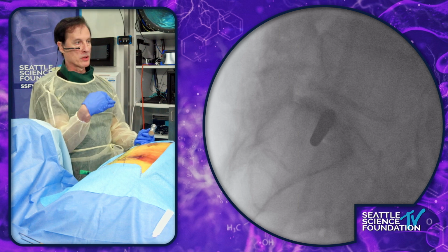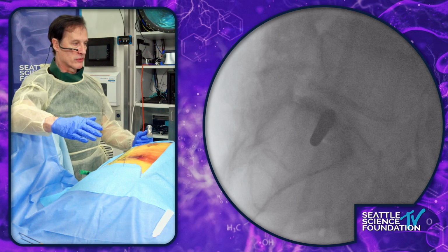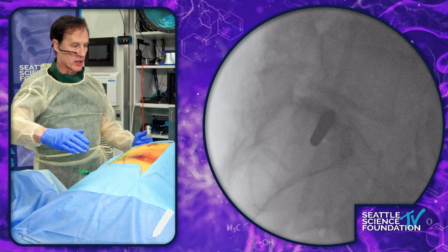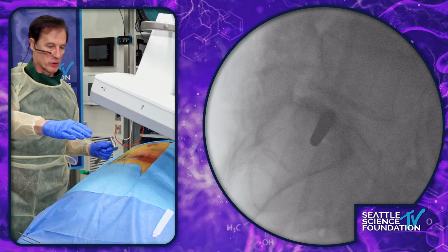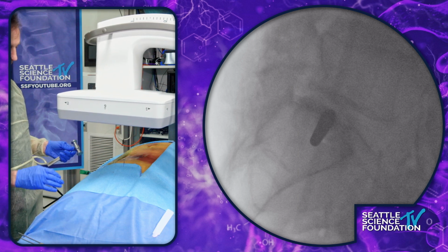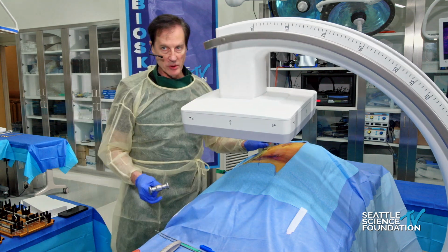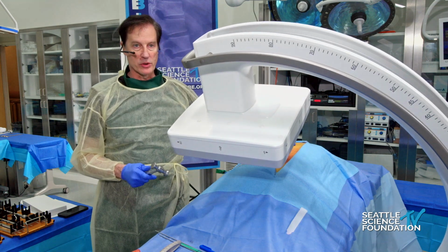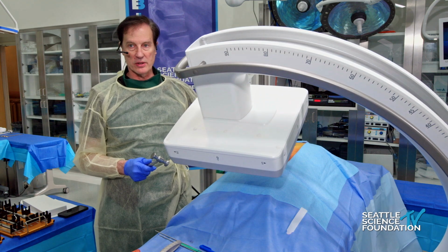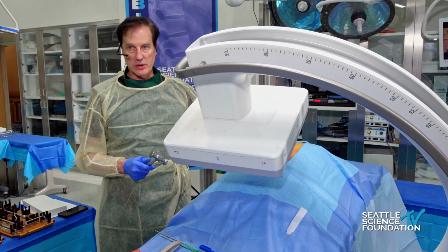So let's come back around. First I'd like to come back around and do the pelvic inlet view, which is looking from the feet up toward the head. The II is looking superior. So we'll come out, tilt the II caudal. And this will be a pelvic inlet view. This is very helpful to look at the anteroposterior portion and to make sure that if you're going to miss on this, you miss high and inside. It's like a brushback pitch from Nolan Ryan. That's what hurts you. And this is right in the center.